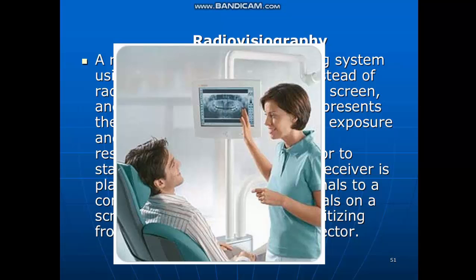It presents the possibility of reduced patient exposure and minimal distortion, although resolution and latitude are inferior to standard dental radiography. A receiver is placed in the mouth, routing signals to a computer, which images the signals on a screen or in print. It includes digitizing from X-ray film or any other detector.